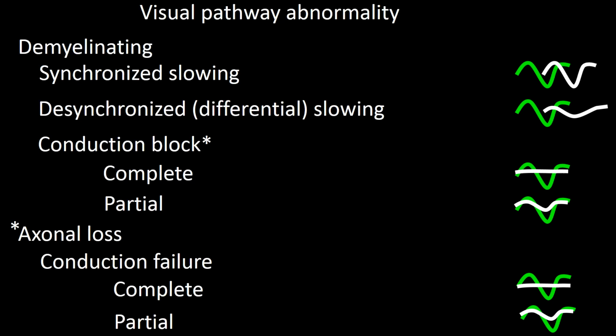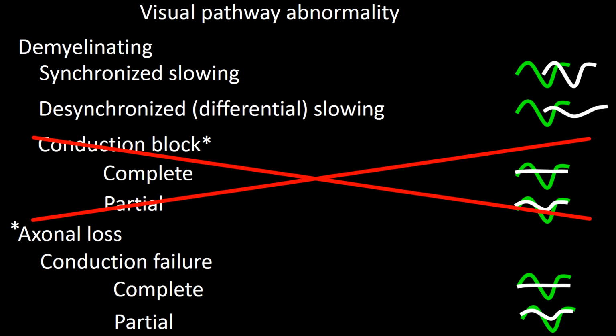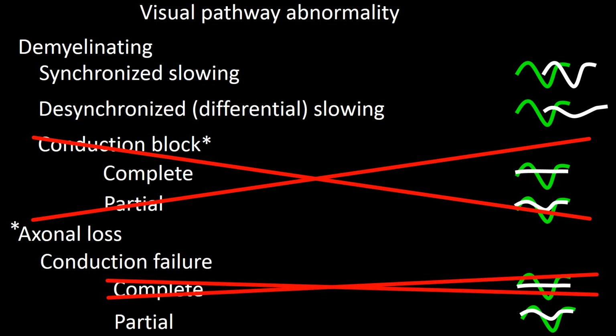Yet, with the current diagnostic tool available, anatomical constraint, technical difficulty, and normal variability, as we have previously mentioned, there is significant restriction to our ability to determine a number of the pathologies just listed. So, conduction block cannot be diagnosed. Complete conduction failure cannot be diagnosed with any certainty, since absence of P100 raises the possibility of a technical problem.